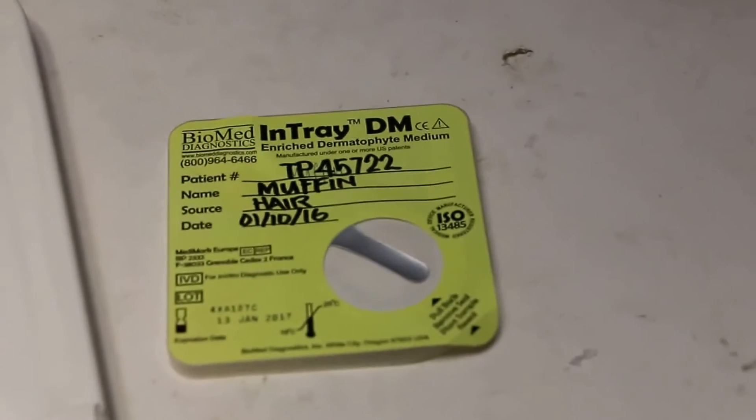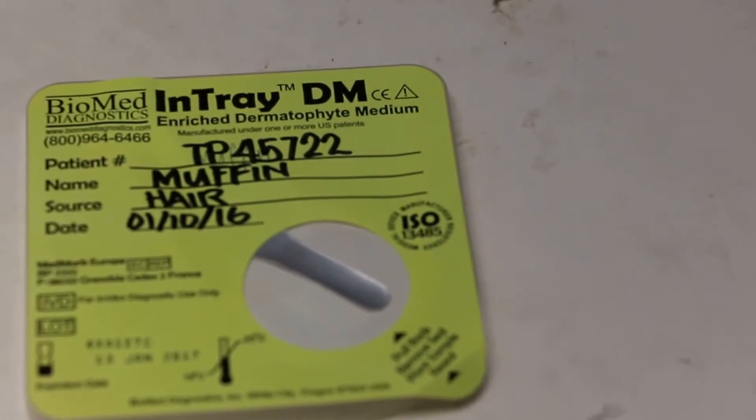You see the InTray medium. She will have already written down the name of the patient and the date on the container. Is the date written? Okay.